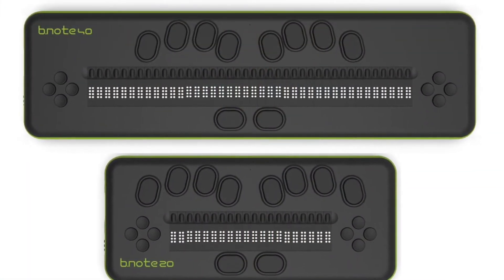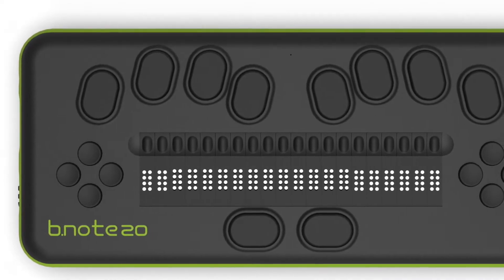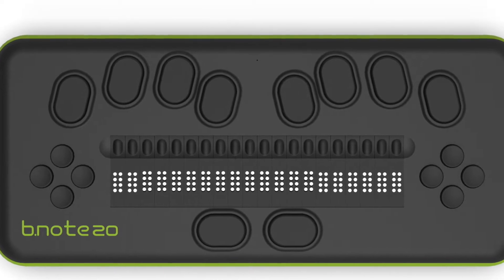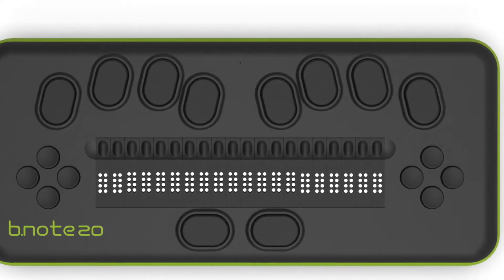This Braille display features a very comfortable 10-key keyboard and two keypads, or four buttons, located on both sides of the device to give easy access to the main functions of the menu.